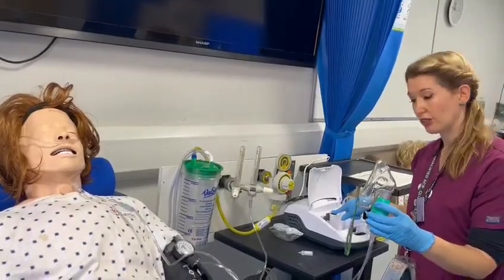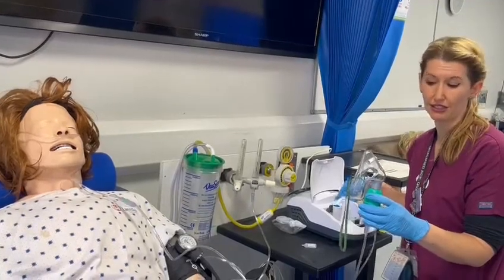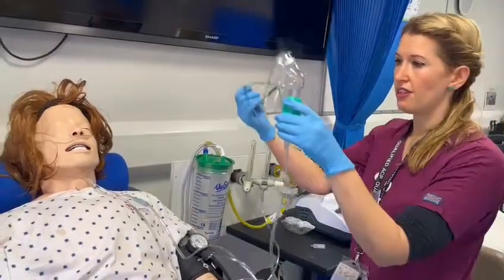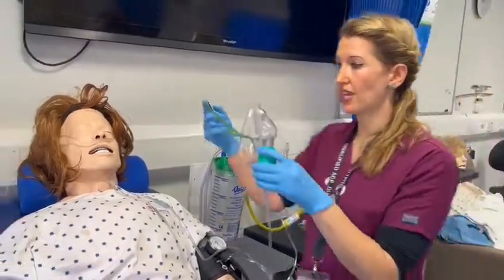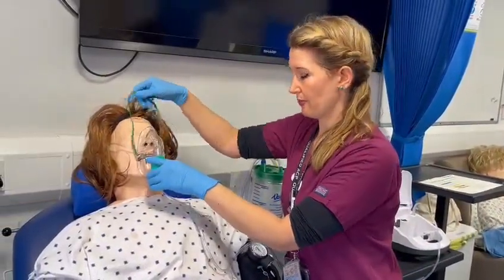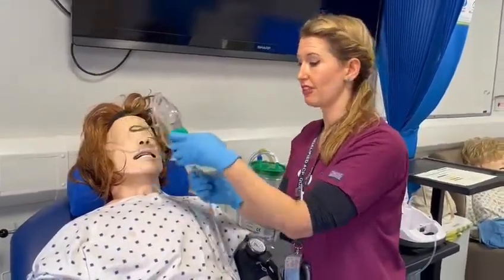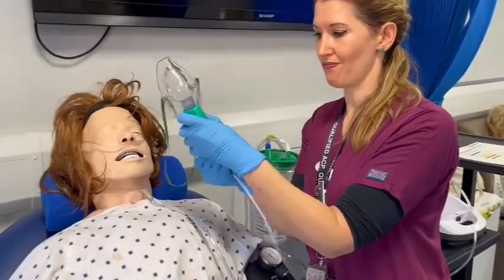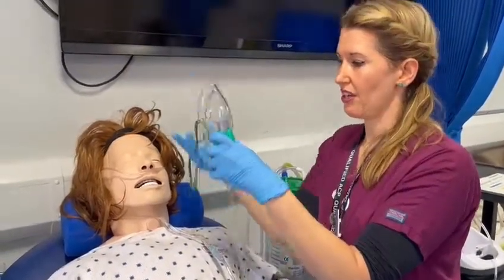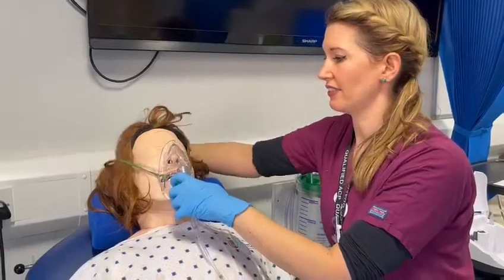In order to switch the machine on, you'll see a green button — press the on button and you're going to hear a bit of noise. Then come to your patient, press this on really firmly, and simply place the mask over their face.